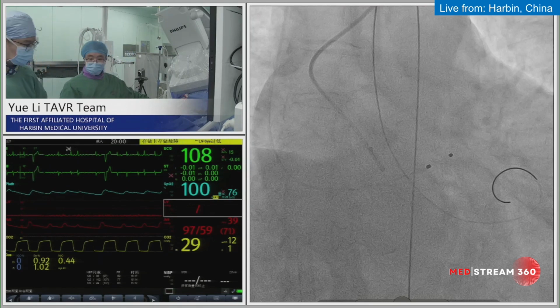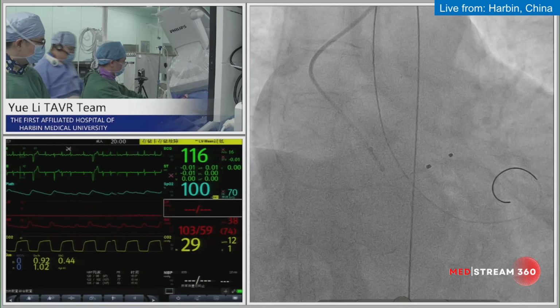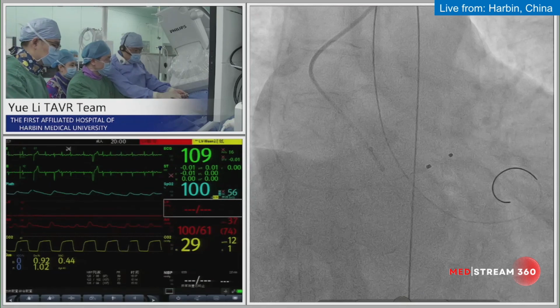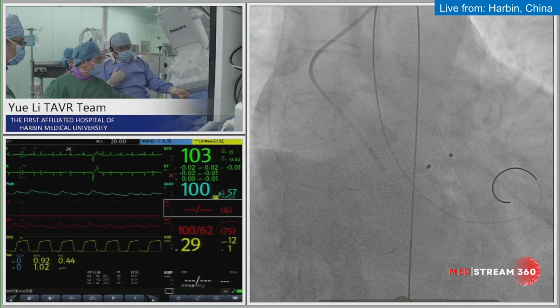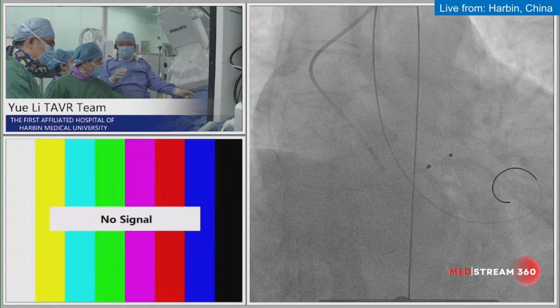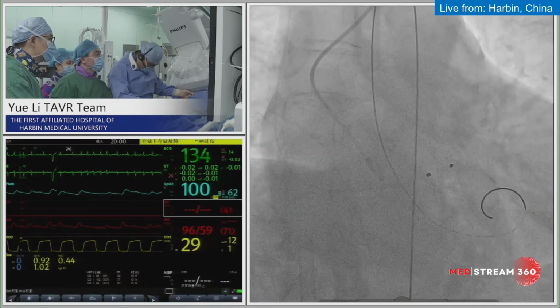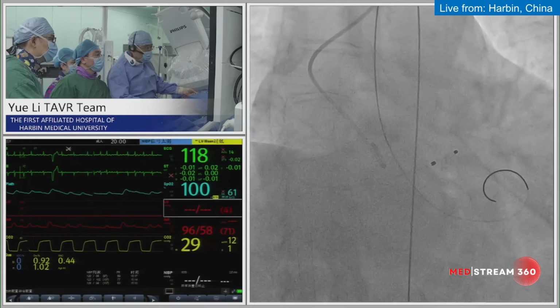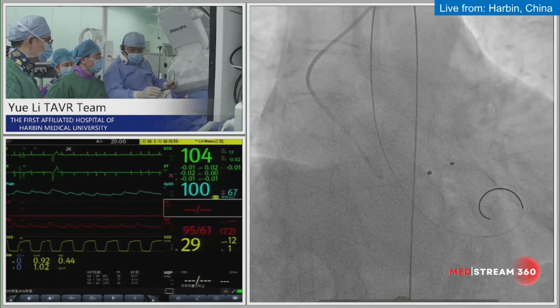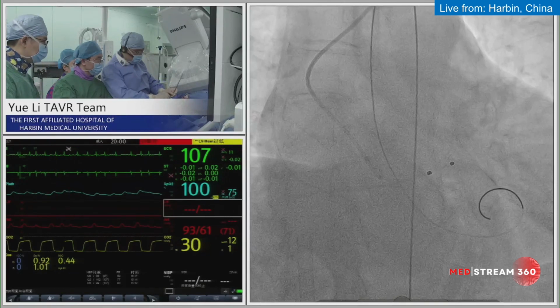For this patient, we did much CT analysis before the operation, and we made this strategy based on the patient having a BAV valve with an annulus of 27.9 and a supravalvular restriction from 4 to 10 millimeters, with the anchorage interval in the range of 24.7 to 27.3 millimeters.